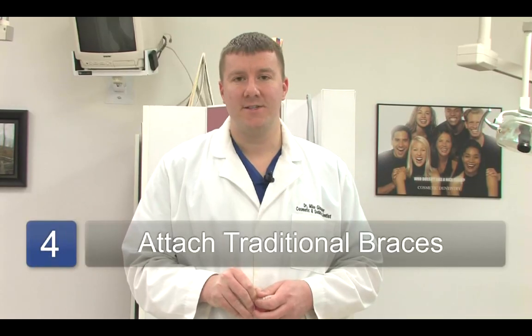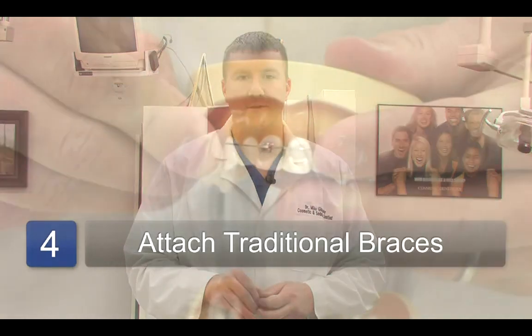If Invisalign is not used, the traditional metal and bracket braces can also be placed, which is an in-house service where the orthodontist will go in and bond the metal brackets as well as the wires to the teeth to initiate the braces.